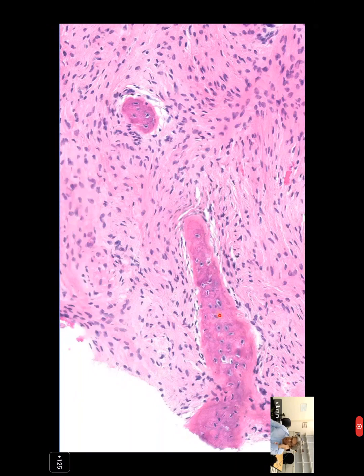The way I do that is I look for osteoblastic rimming, and I know you did talk of osteoblastic rimming. Typically, osteoblasts look like plasma cells, and we'll see some osteoblasts as we go along. They look very much like plasma cells with the nucleus on one side and the cytoplasm on the other. And to my eye, we're not quite seeing that. In fact, there is a flattened layer of cells. It doesn't mean these couldn't be osteoblasts, and maybe they are, but they are not the plump osteoblasts that you see with reactive bone. If I'd seen plump osteoblasts lining this bone, I would have said, oh, it's just reactive bone.